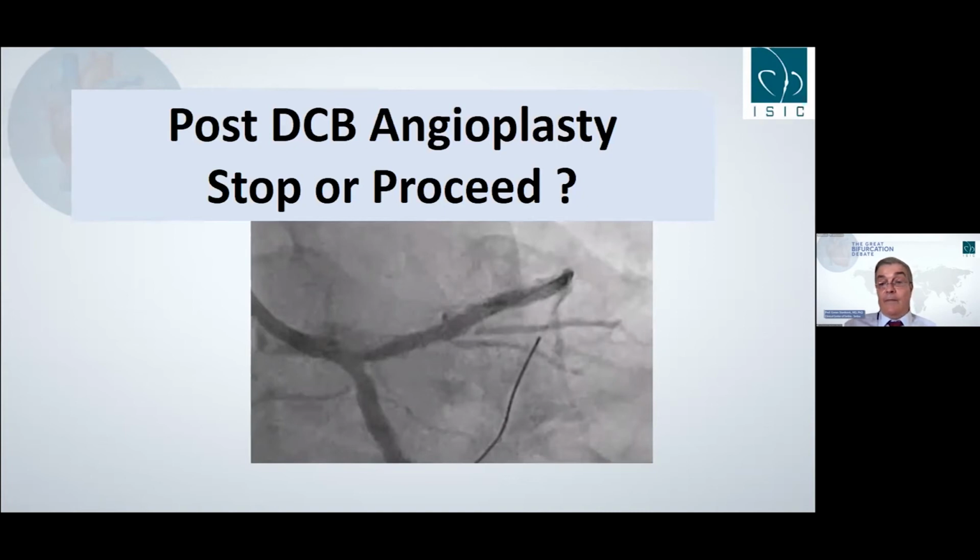Yes, this is a very challenging case indeed. In my view, I would choose to apply the two-stent strategy in this particular case because, as you mentioned, there are stent struts protruding into the left main. So my choice for this two-stent strategy is the DK crush technique.